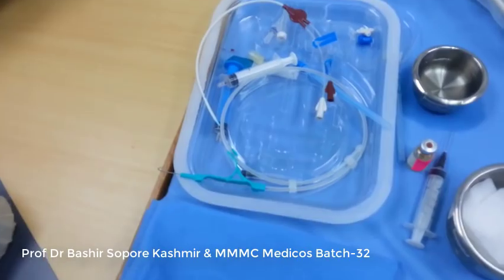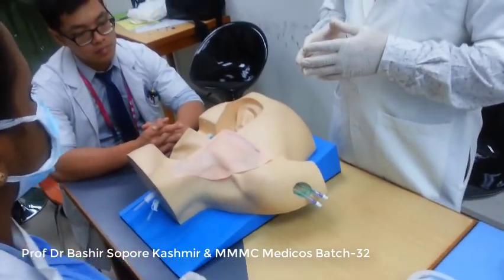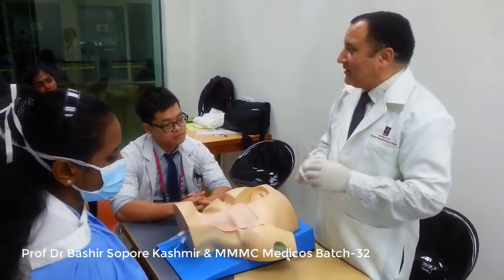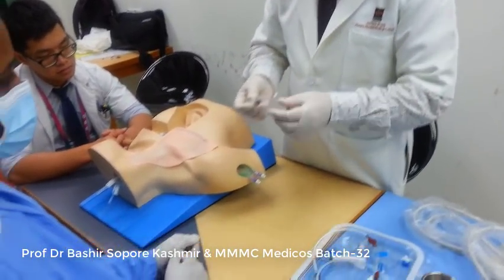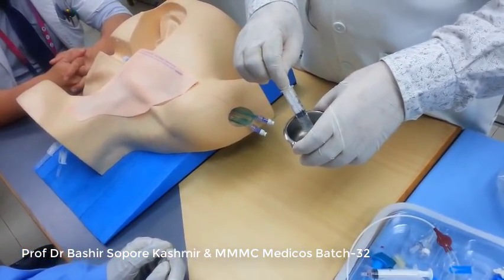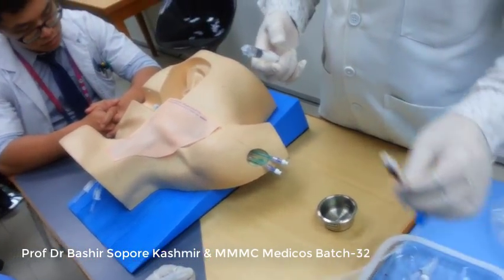Yes. Now, what is the next step? Prepping the skin. The next step is to check whether they are patent or not. So what you do is you take the syringe like this. You understand my point? And you take normal saline. You take 10 ml of normal saline and see whether everything is patent or not.